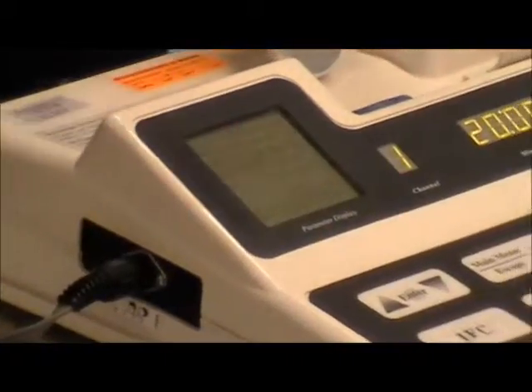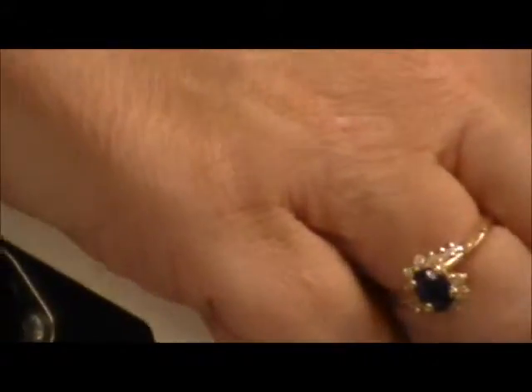Okay? So maybe I wanted low rate, but I didn't want all the way up to 10. Maybe I just wanted 2 to 4 pulses per second. So take this down to variable, hit enter, and then it says beat low. And now you use your, I can't remember which button it is. You can raise that up. So I want my beat low to be 2. Okay.